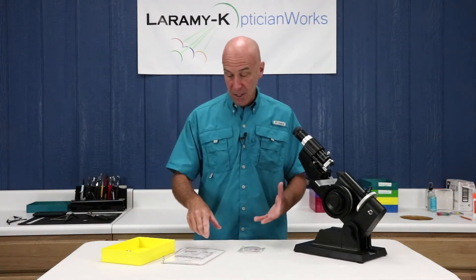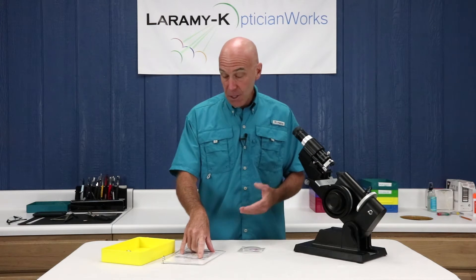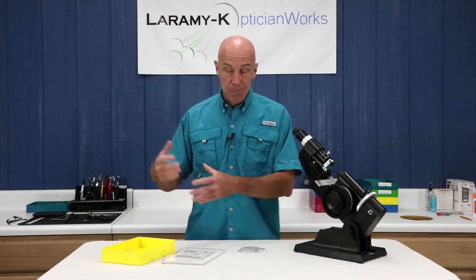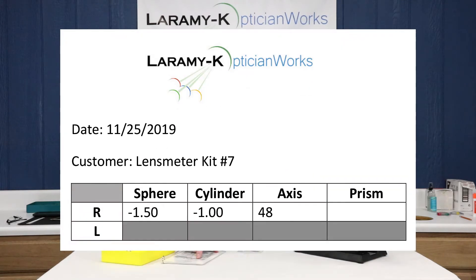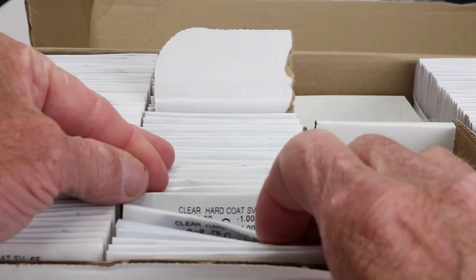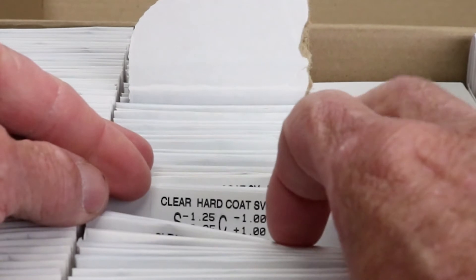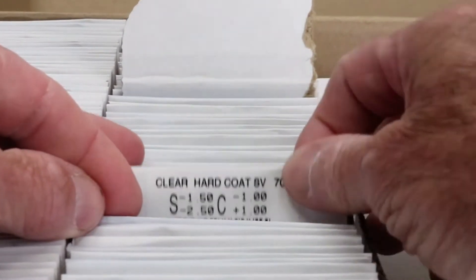Take a look at lens meter kit number seven here. It tells us that for this particular job, if a customer was waiting out front, I needed to pull a lens, line it up, fill it — minus 150, minus one, and the axis is 48. I would stock these lenses, stock single vision uncut lenses. I'd go over to the trays, dig through, and find a minus 150, minus one.